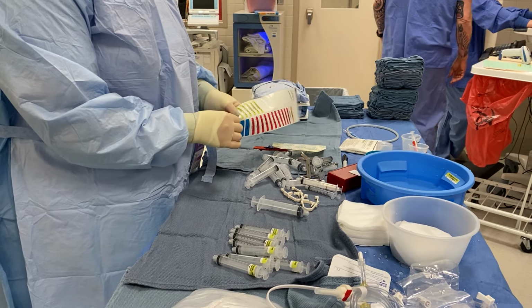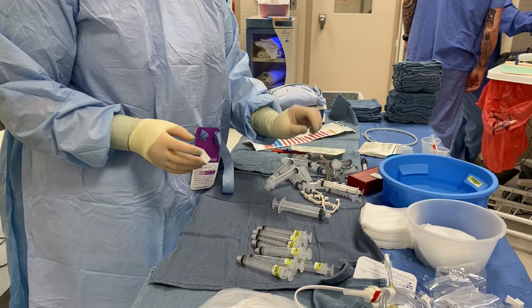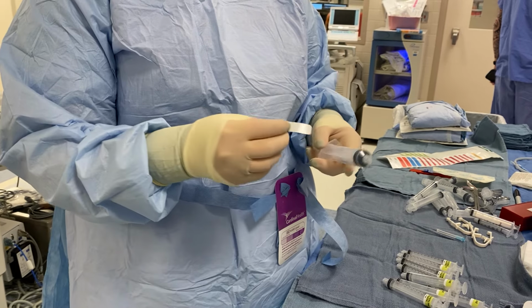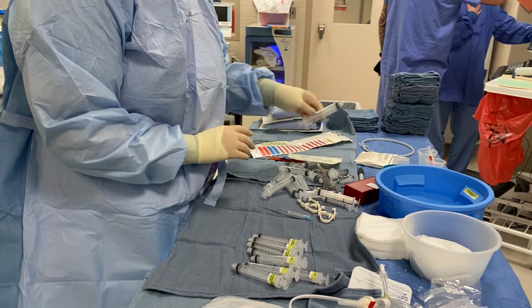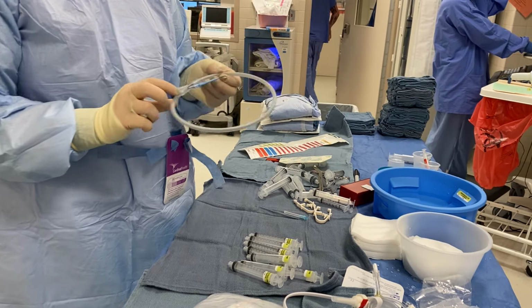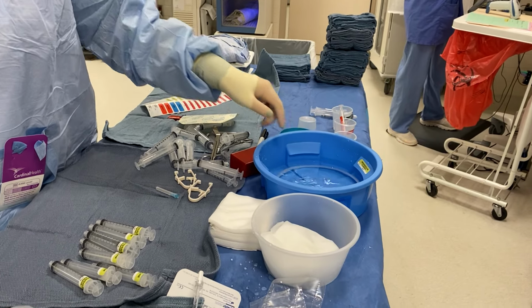And then finally, the syringe that's gonna be used to give the radial cocktail. For this doctor, he likes to give it in a 20 cc syringe, so I'm gonna stick it on the same way. This is just a blank medication sticker. This wire, we always like to keep it wet if we can, so I'm just gonna put this right into our saline bowl so that it could sit in the saline.